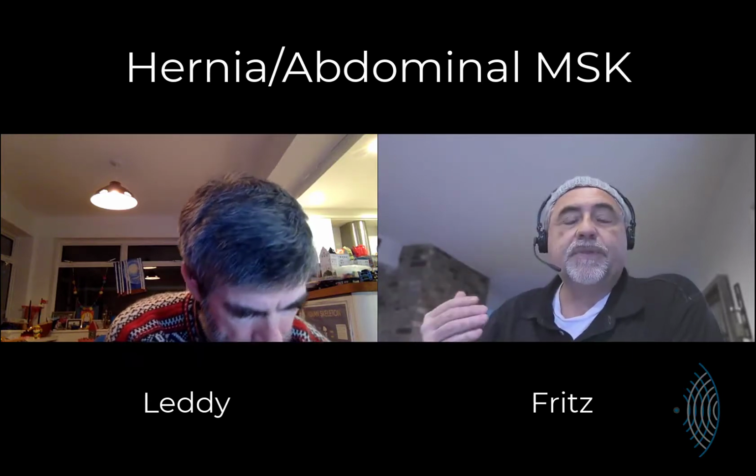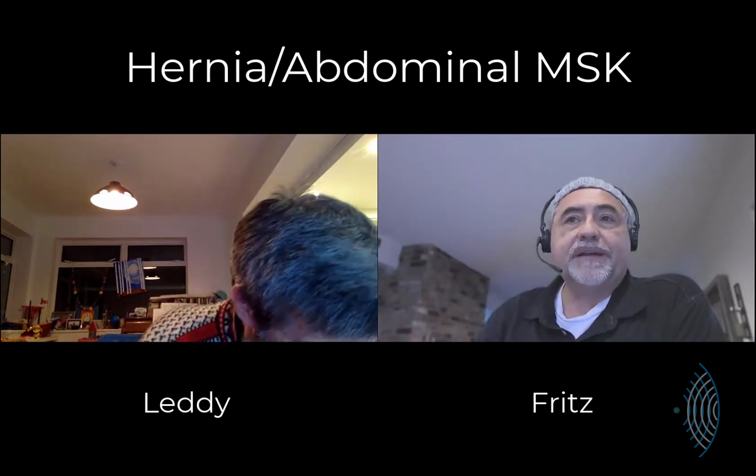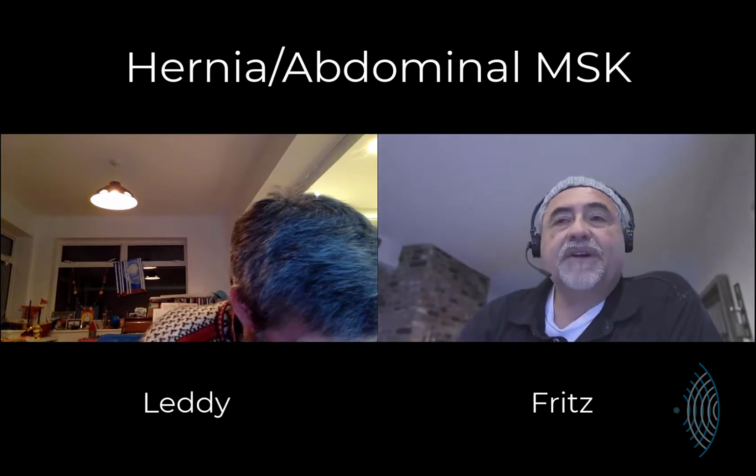So what I would like to ask you, because I know you're a hernia imager: if my eyes look at the tomographic slice and I see skin, adipose, muscle, and then that bright layer of abdominal fascia before I get to the gut, if I'm doing general scans, could he have compromised that? Or should my mind say that's never going to happen, that you didn't see it in 25 years of scanning in a random area of the gut?